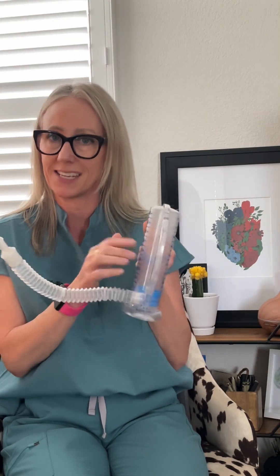At the end, if patients can, teach them to hold their breath for five seconds — this helps pop the alveoli open a little more, creating better gas exchange. Then have them do some coughing and deep breathing exercises: take some deep breaths in and then repeat the spirometer use. Do this 10 times an hour. That's how you use the incentive spirometer — teach your patients how to do this correctly. Have a great day!